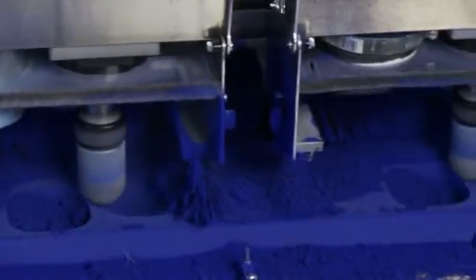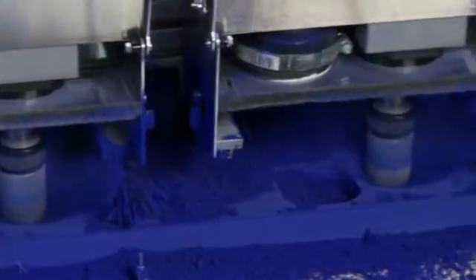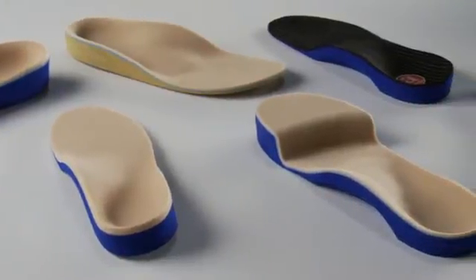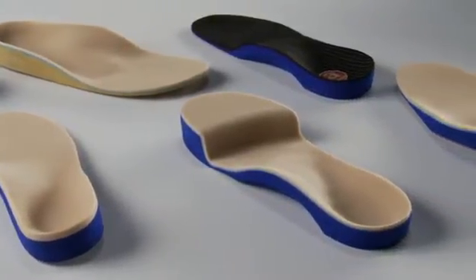Amfit orthotics are designed to treat a number of pathologies, ranging from general foot pain and discomfort to severe conditions such as diabetes, plantar fasciitis, and arthritis.